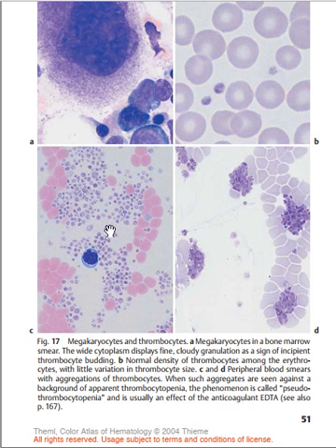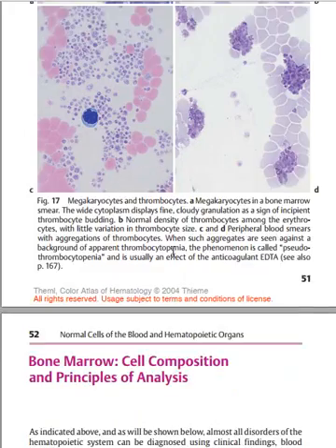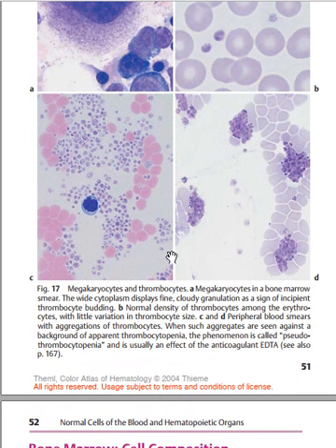In diagram C, you can also visualize different thrombocytes here. Thrombocytes are the smallest blood cells. Is it clear? They don't contain any nucleus, but they contain only cytoplasm with different granulation. You see that the granulation is absorbing azure or absorbing methylene blue. That is why they can be said to be azurophilic or basophilic, because they are bluish. Is it clear? So from here we are finished with the first part of the tutorials and will continue in the next part.